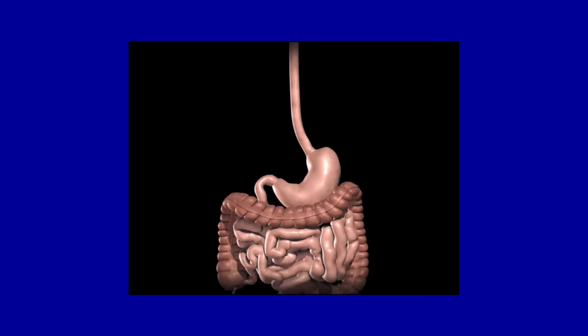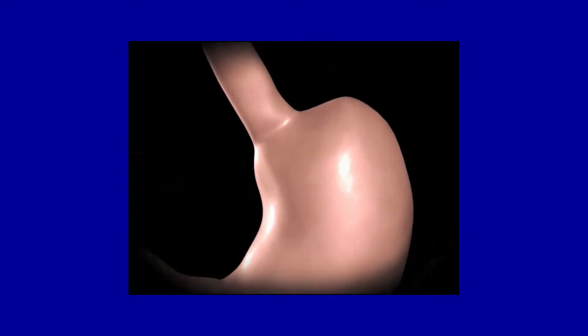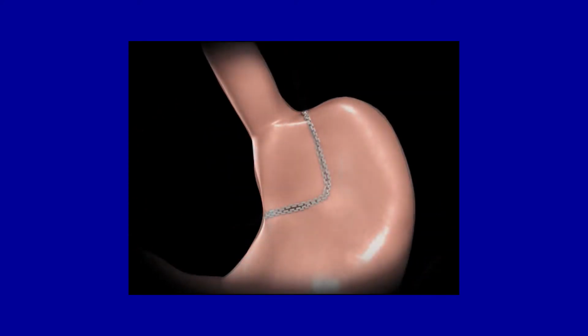So when food is in the stomach and fills up the stomach, you get physical fullness, and the brain shuts down its desire for food when it gets into the small intestine. So remember that so you can understand how the gastric bypass works. So the first thing we'll do in a gastric bypass is we'll go to the upper part of the stomach where we talked about putting a band in, but instead of putting a band in, we're going to cut the stomach into 2 pieces with surgical staples.